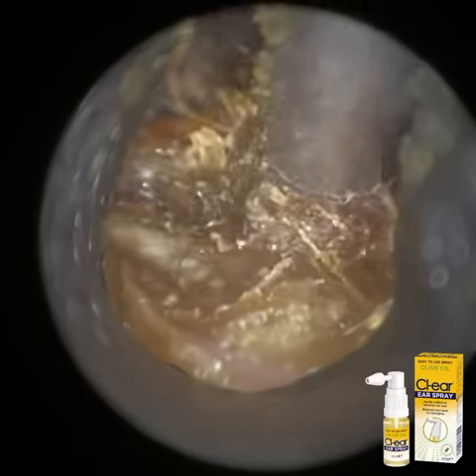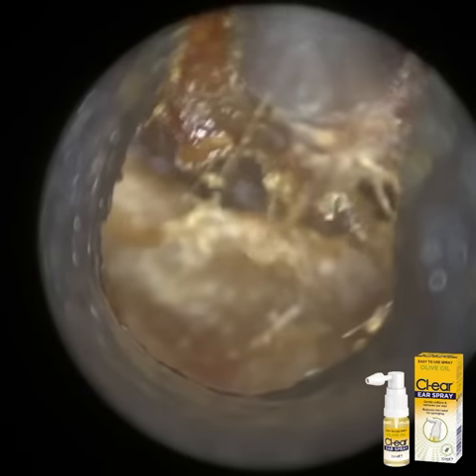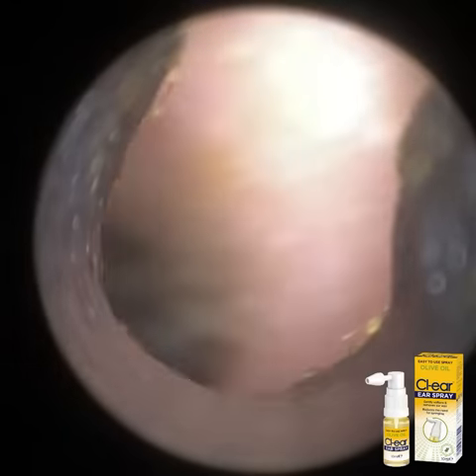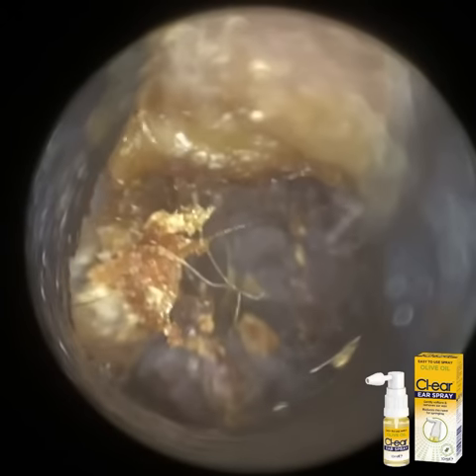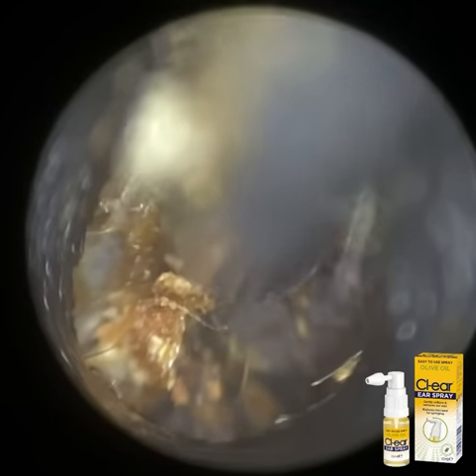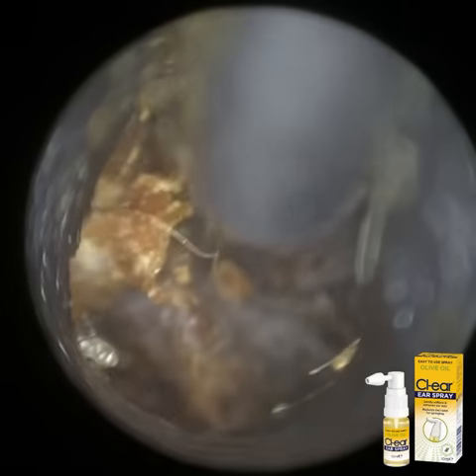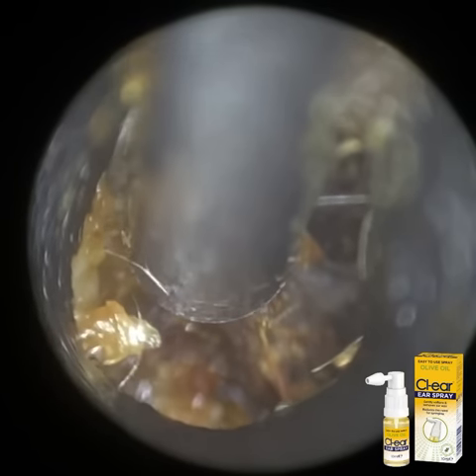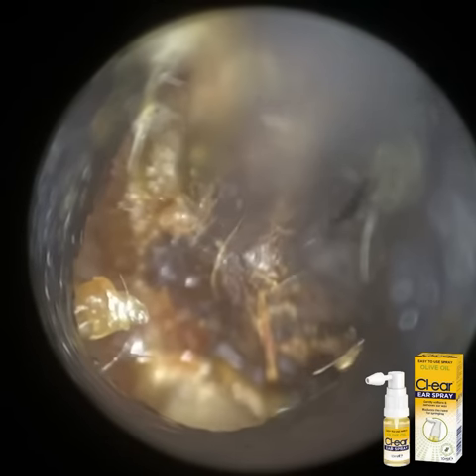So what the olive oil does, if you've been watching my videos, I always like to make food analogies. And the olive oil I would compare to an egg, for example, in a potato cake or fish cake recipe. It helps to bind the wax together, so it's easier to suction. It also provides some lubrication to the ear canal walls, and it also lubricates the internal suction unit. So as we're suctioning the wax, it just tries to stop it from getting blocked inside the suction probe.